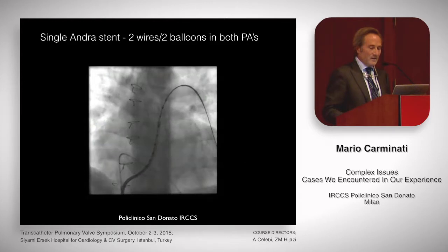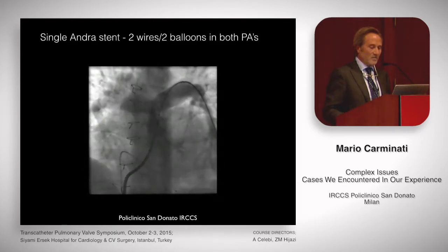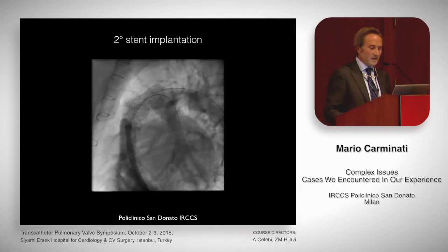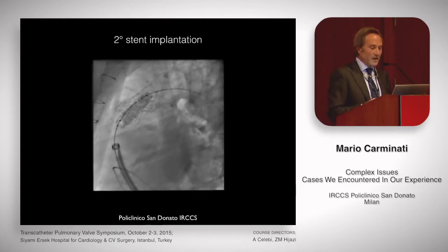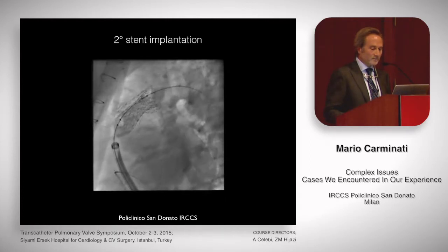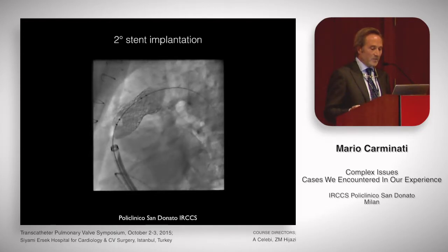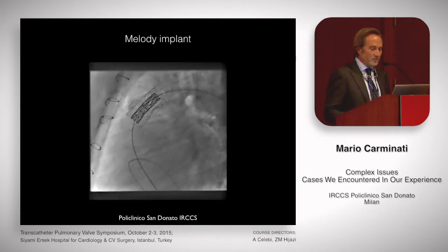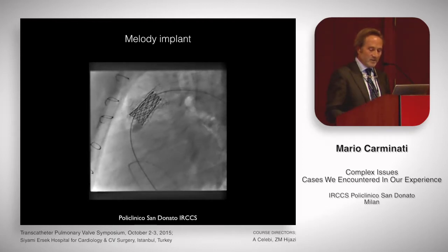You see the bifurcation stenosis, the two wires, the two balloons, and a single stent — expansion of the distal portion. Then we draw the sheath and expand the rest of the stent, eventually achieving a stable position and abolishing the residual stenosis.